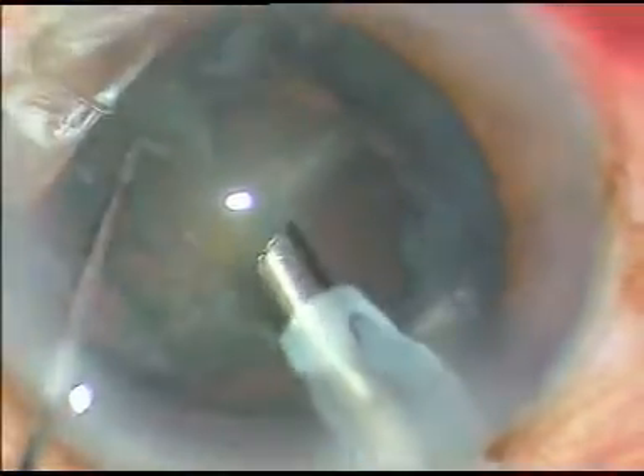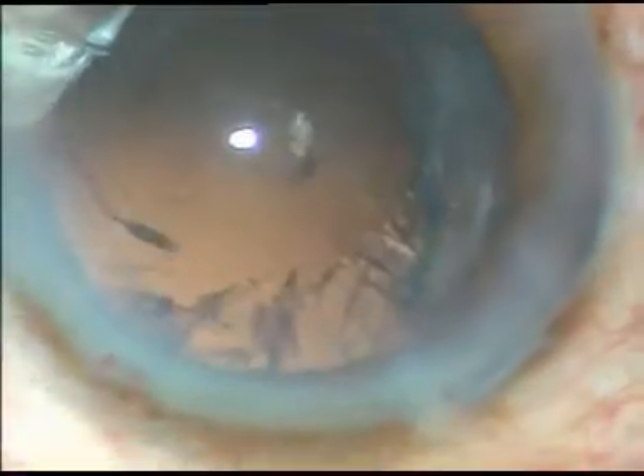The nucleus is almost eaten up. This is the last piece, the last fragment of the nucleus, and now the epinucleus. The epinucleus is brought to the center with high vacuum in the same setting and is removed.